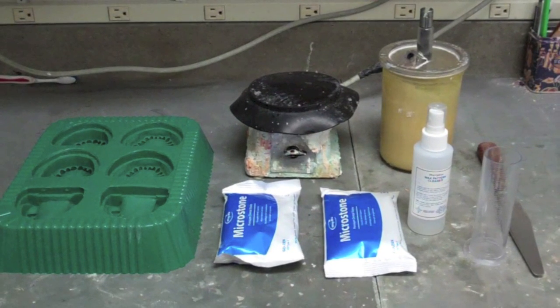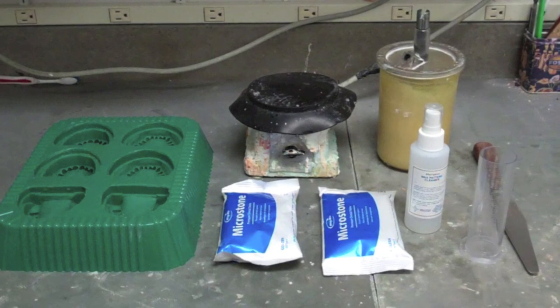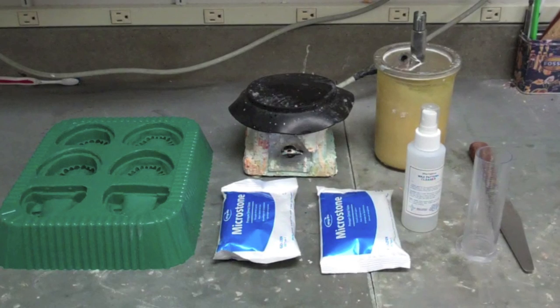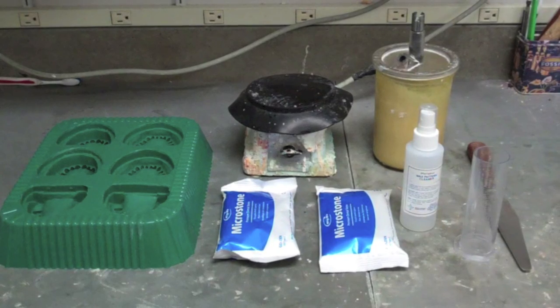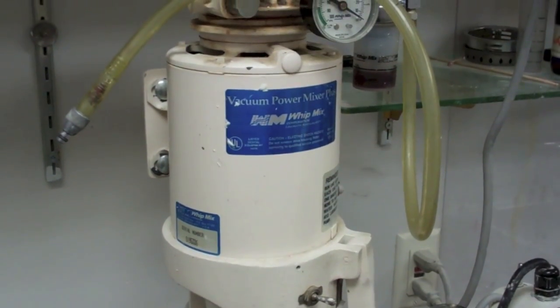For this exercise you will need the molds, a vibrator, stone, Wipmix bowl, spatula, debubblizer, and a graduated cylinder. You will also be using the vacuum-powered mixer from Wipmix.